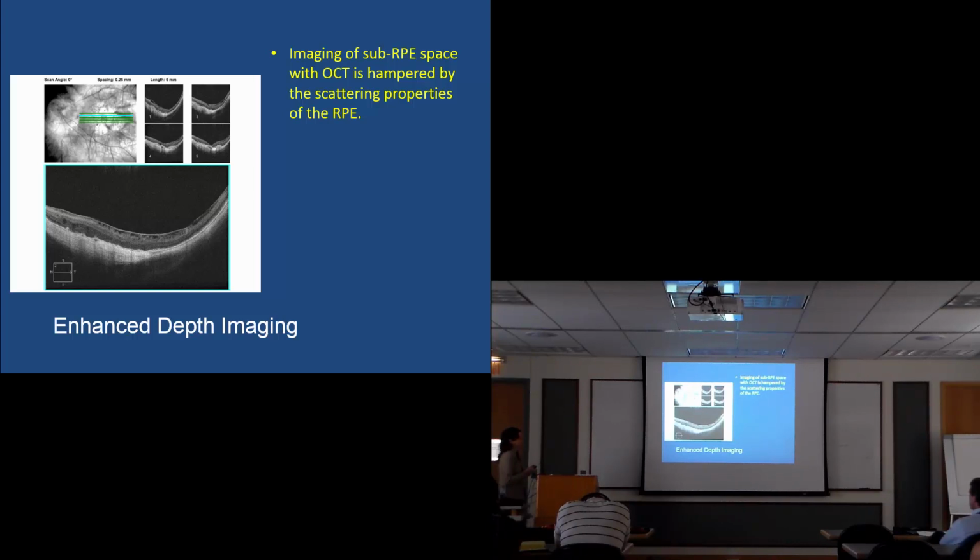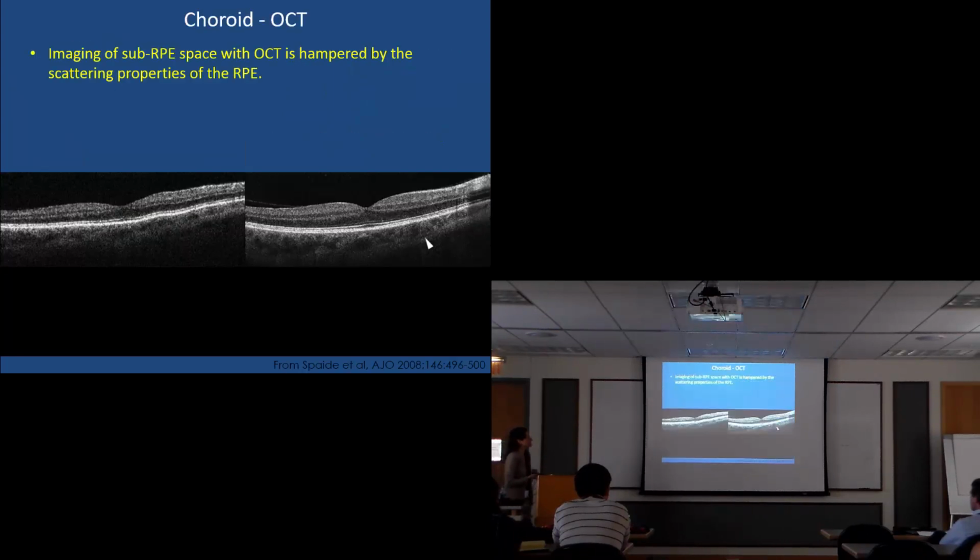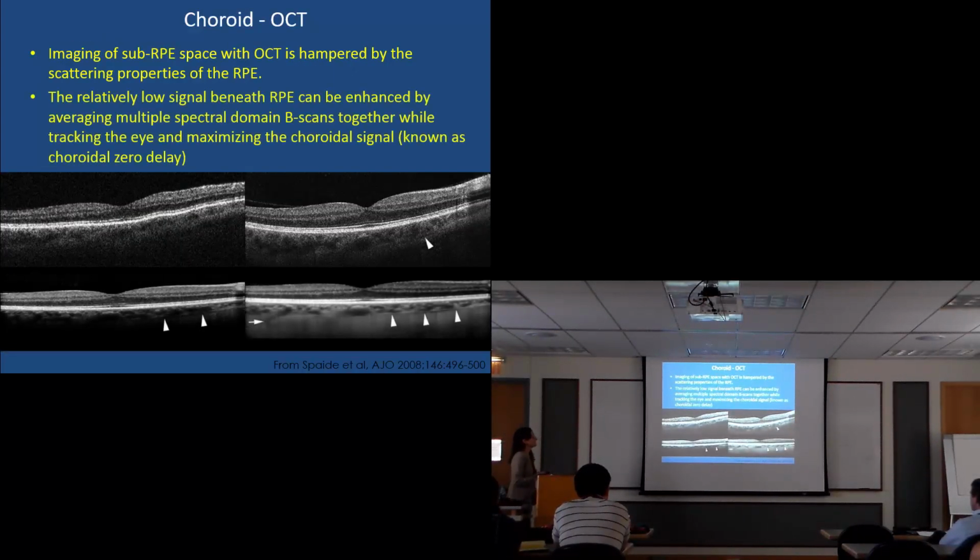Patients who have nearsightedness, this is how thin a healthy nearsighted person, this patient can see 20/20. But a weird retina, because it's bowed back because of a staphyloma, they're myopic, so their axial length is longer. They have an epiretinal membrane here. But really, what's most frightening is that the choroid blood flow is so thin. So we think that these patients, high nearsighted patients, can be at risk for features like macular degeneration. Again, we're understanding that the choroid is important only because OCT was invented. So this is a normal choroid, and to evaluate the choroid, how can we improve it? This is where a lot of focus is going.